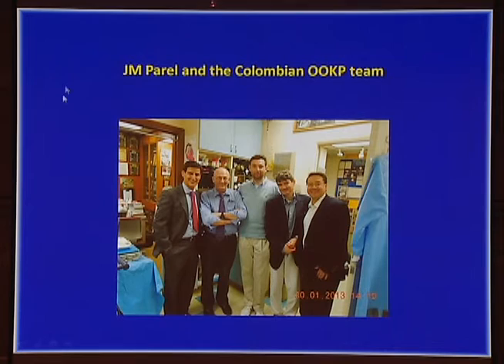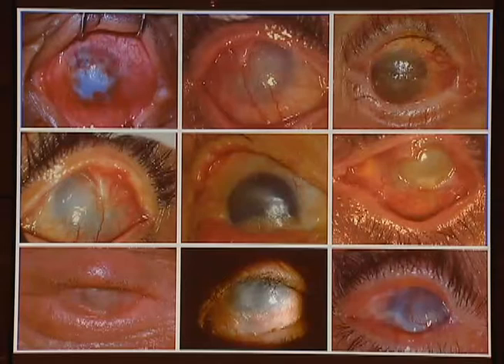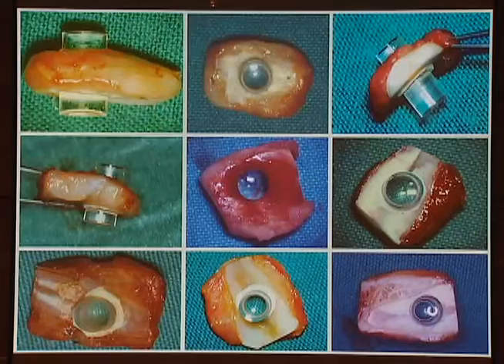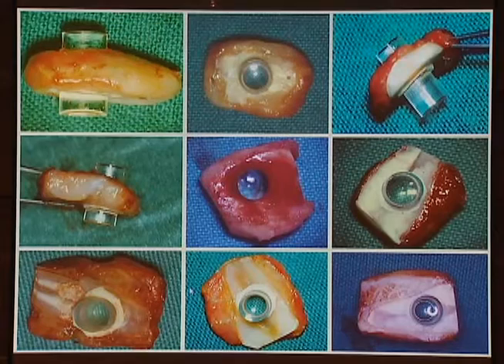We see again these very problematic eyes. These are the laminae used for the procedure. Results.